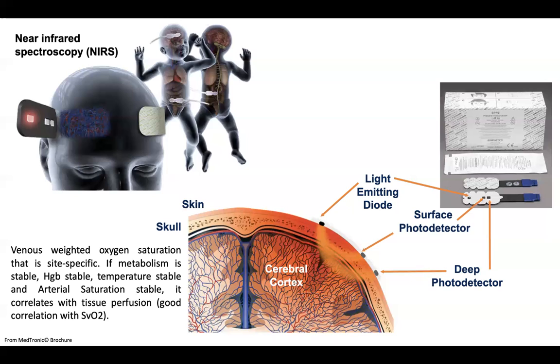And we've also been using some of the other types of dressings, adhesive dressing, in order to solidify some of these probes. But you have to be careful when you're using any kind of these adhesives, and you have to refer to the manual and to the experts from the companies that are going to be selling either the probes or the monitors, and be specific with your equipment, and train obviously all your personnel to be at ease with monitoring. The other thing is that these probes are typically not compatible with MRI, so be sure that you remove it prior to any kind of MRI.